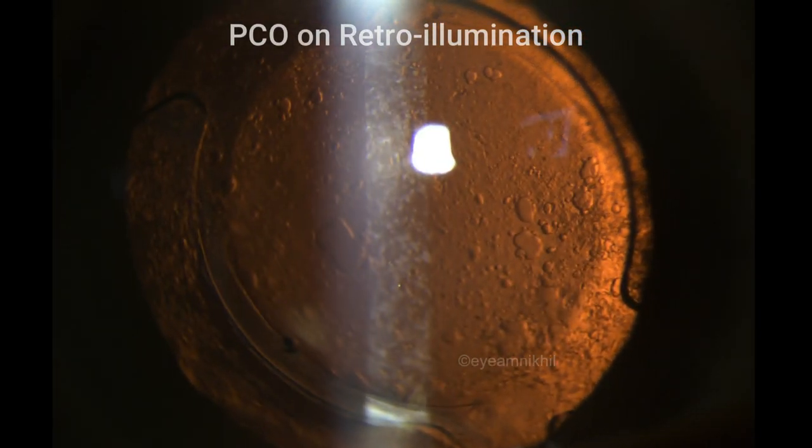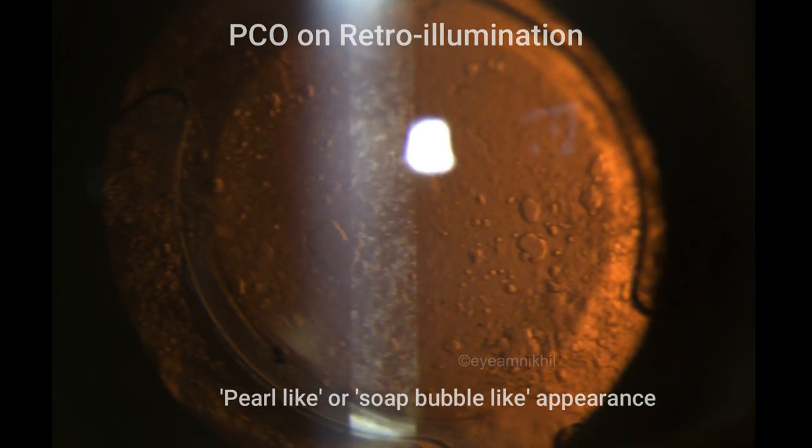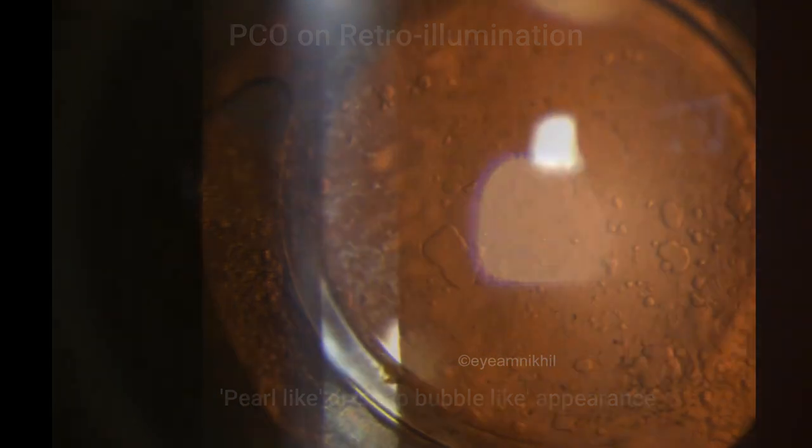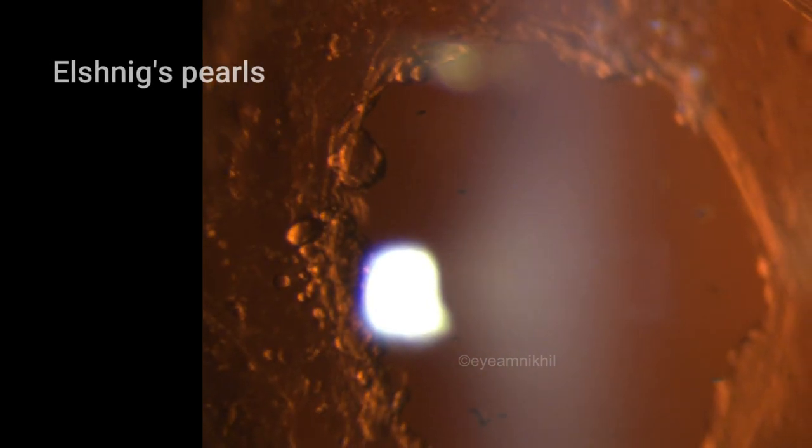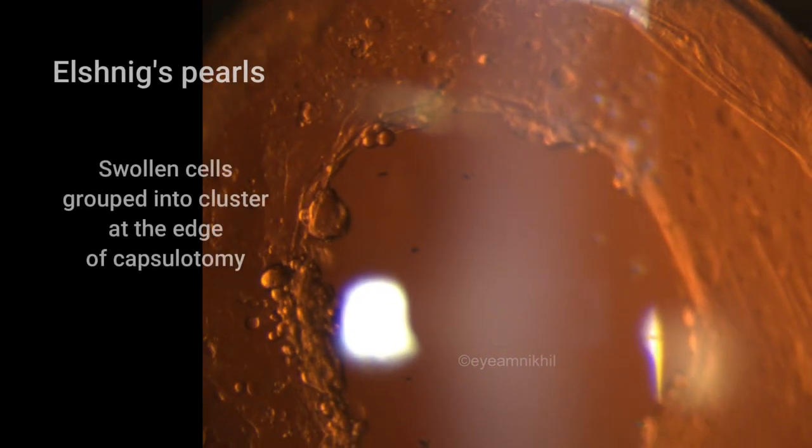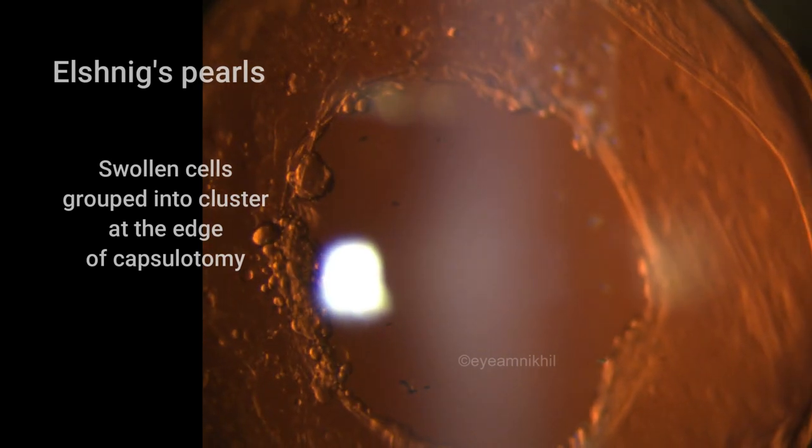The term Elschnig's pearl is particularly used when the swollen cells are grouped into a cluster at edge of capsulotomy.